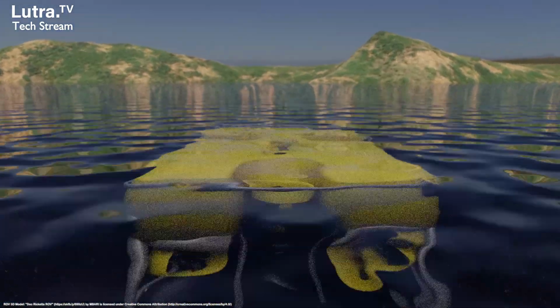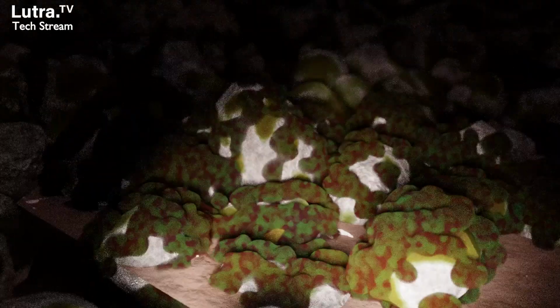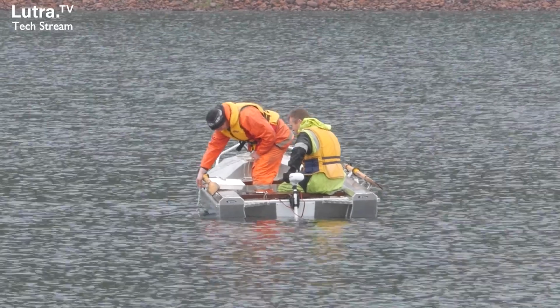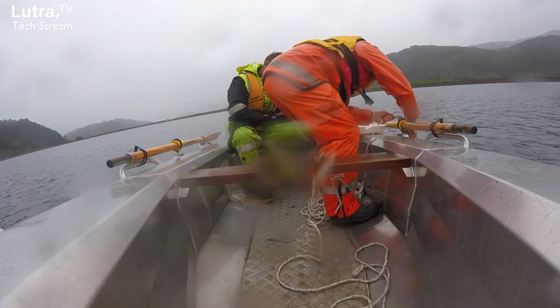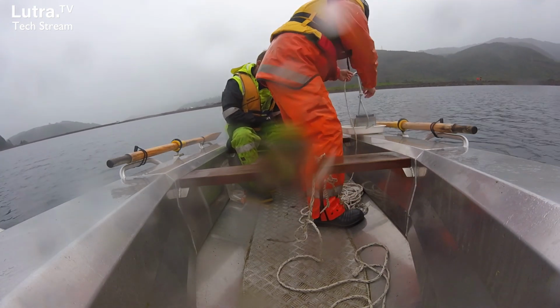And so that's when you look for things like those musty aromas, the earthy undertones in your water supply, and you don't have other cyanobacteria to explain it. That's when you maybe need to think, okay, do I have benthic cyanobacteria present? And then it gets a little bit tricky. We're looking at dropping cameras down into the bottom of the reservoir. We're sending divers in to try and see it. Or we're taking sediment grab samples where we've got a claw and it goes in and pulls up some of the mud from the bottom. And we have a look around in there to see if we can find cyanobacteria.